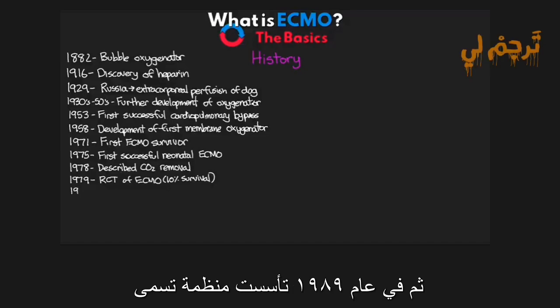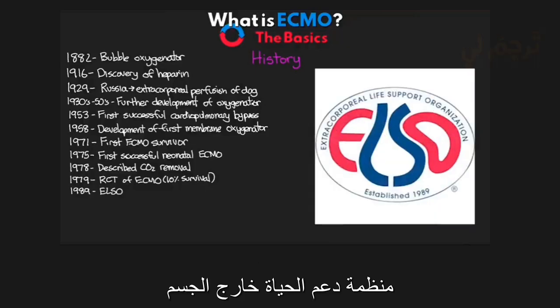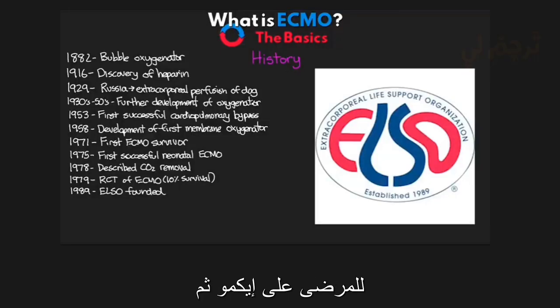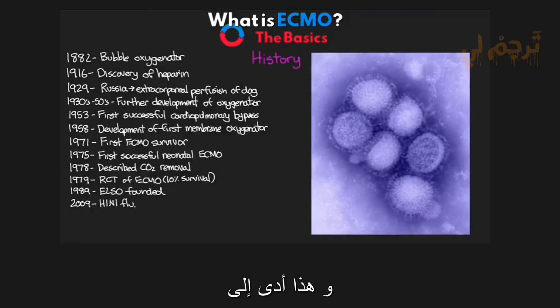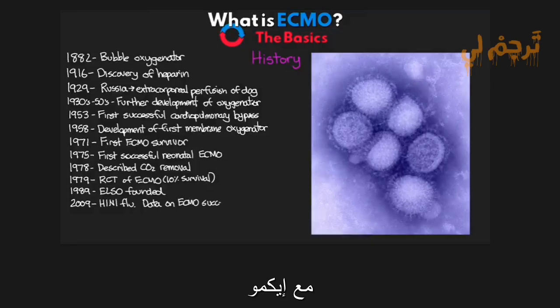Then in 1989, an organization called ELSO, which stands for Extracorporeal Life Support Organization, was founded. They were founded with the purpose, and really continue a lot of this today, of data collection and accumulation of best practices for patients on ECMO. And then jump forward to 2009, we had the H1N1 flu pandemic, and this led to a huge collection of data of the clinical successes that people were having with ECMO.